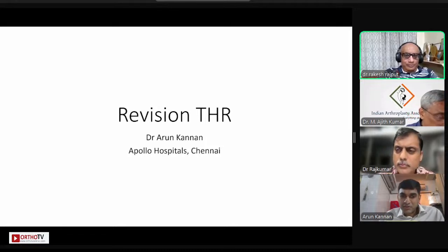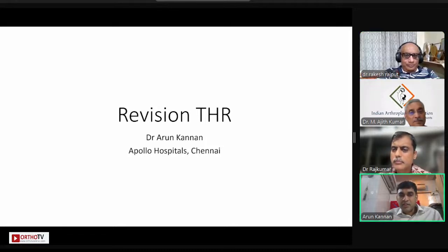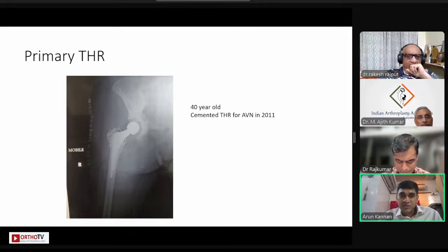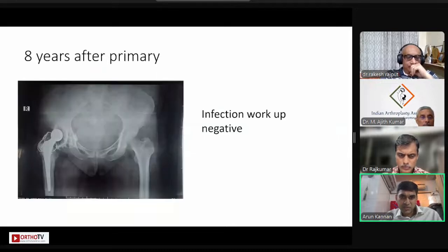Yes, sir. Good evening, all of you. Thanks for the opportunity. So this was a 40-year-old patient. In 2011, she had undergone a cemented THR for AVN. This was 8 years after the primary. This is when she first saw me.